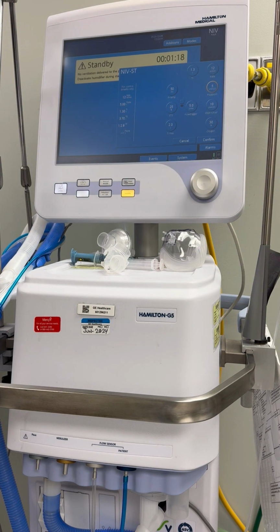So if I were to translate these settings to a V60, I would expect the settings on the V60 to look like 15 of IPAP over 10 of EPAP. So that would give me 5 of pressure support. So that is how those settings translate. So you're not going to set these settings like you're going to set it on a V60.